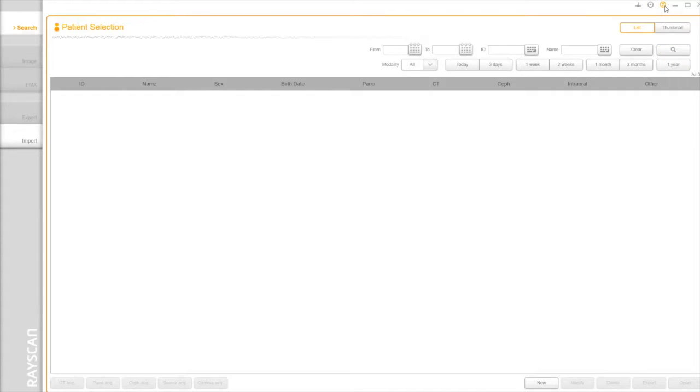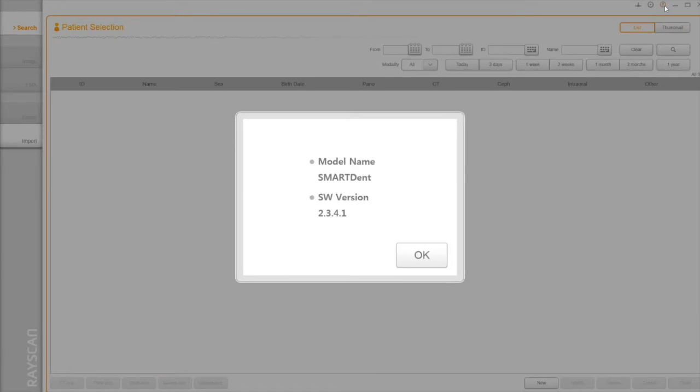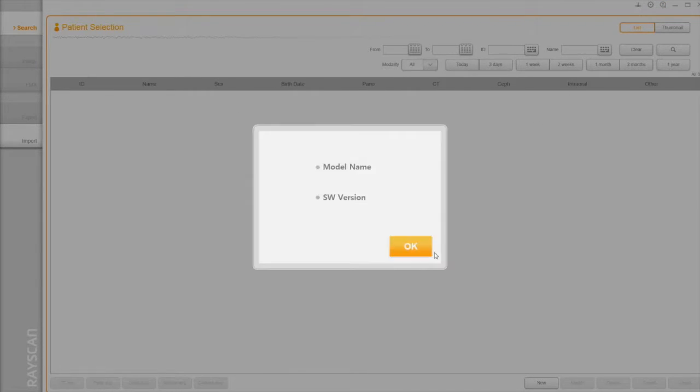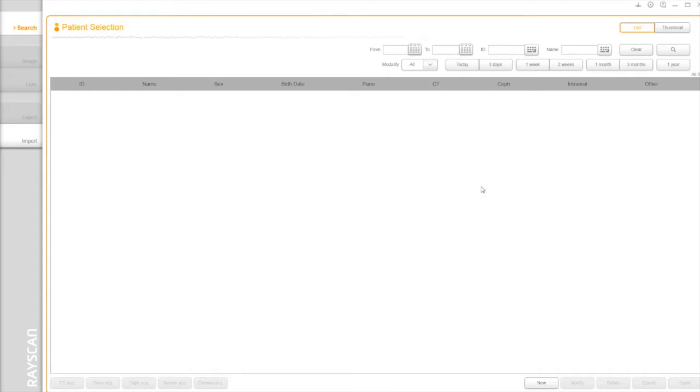To check the version of software, click the Question button. You can minimize, maximize, or close the software on the top tray.